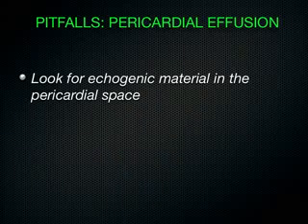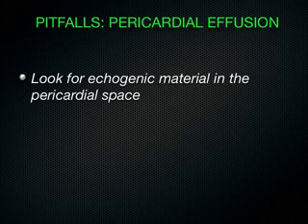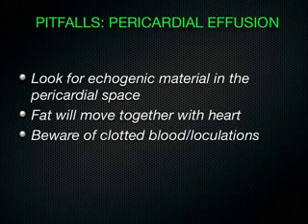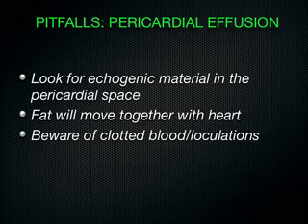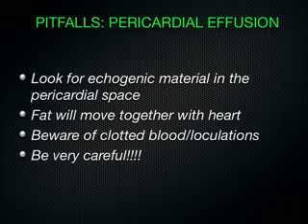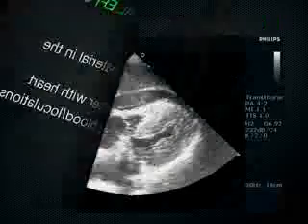When you're talking about pitfalls of pericardial effusion, you want to worry about any echogenic material there in the pericardial space, because guess what? Fat can mimic a pericardial effusion because you'll see a separation between the myocardium and the pericardium, but the fat is tacked down to the heart and moves together with the heart. You want to worry about any blood collections, loculations in that area. You want to be careful not to overcall these things, and especially in the setting of trauma, send a patient for an unnecessary pericardial window or even thoracotomy. And so that's why we've got to be very careful here.